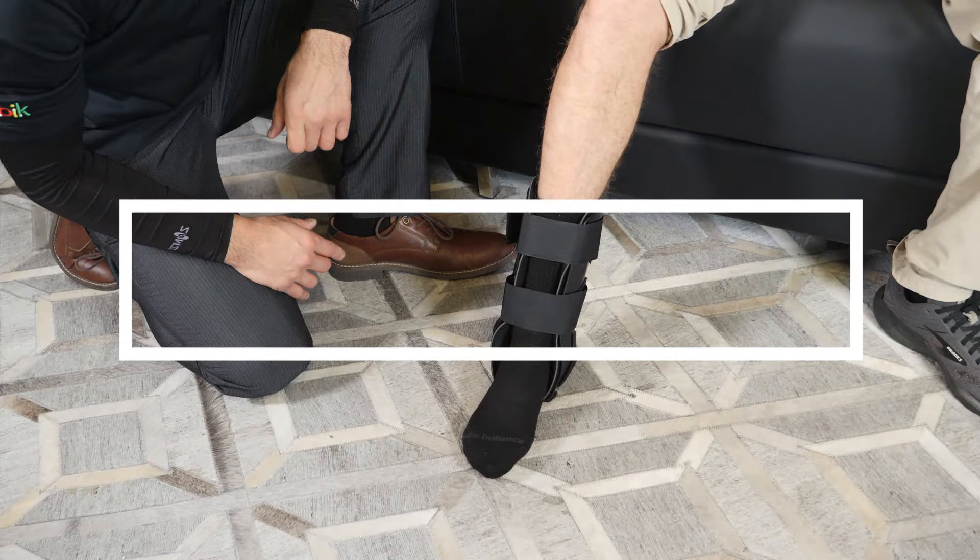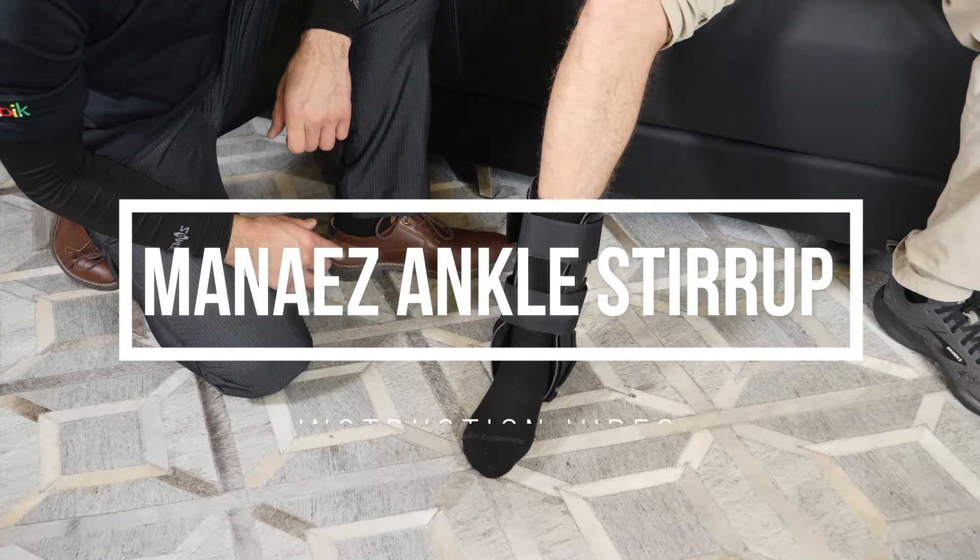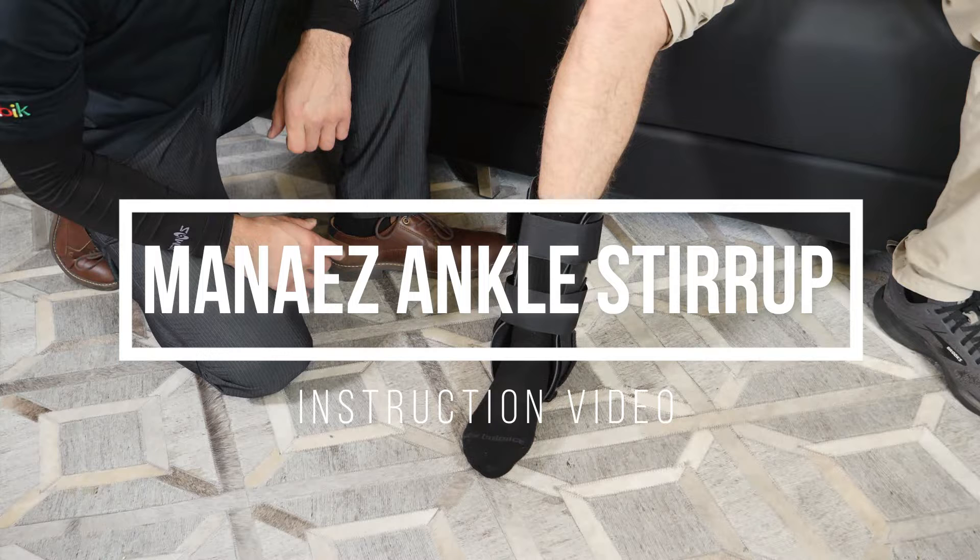An ankle stirrup splint is used after an injury to increase comfort and limit movement. The splint squeezes your ankle between two plastic pads. The pads are filled with air to cushion and support your ankle while it heals.